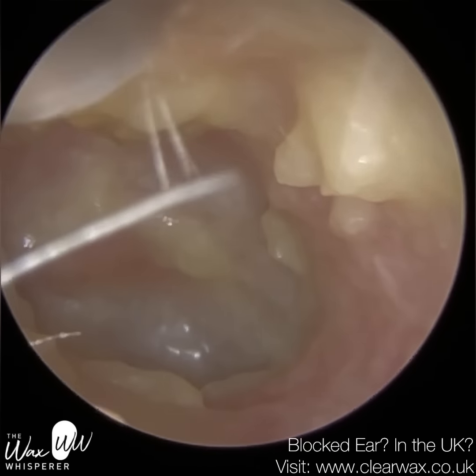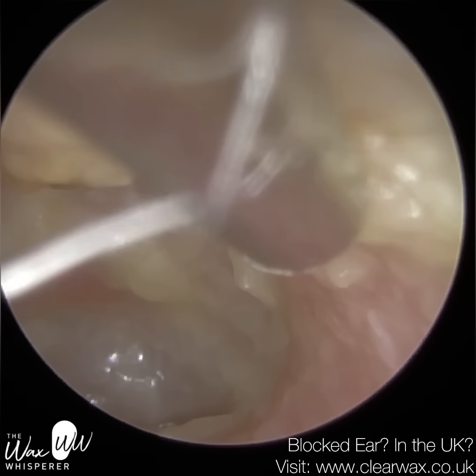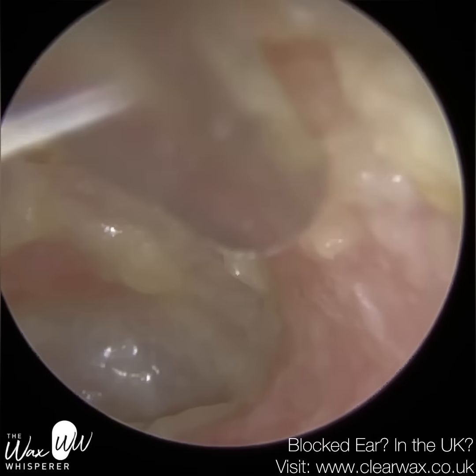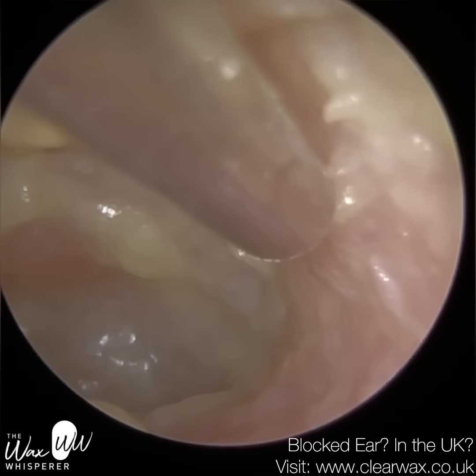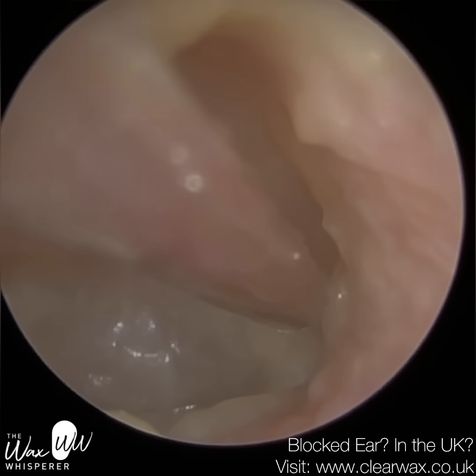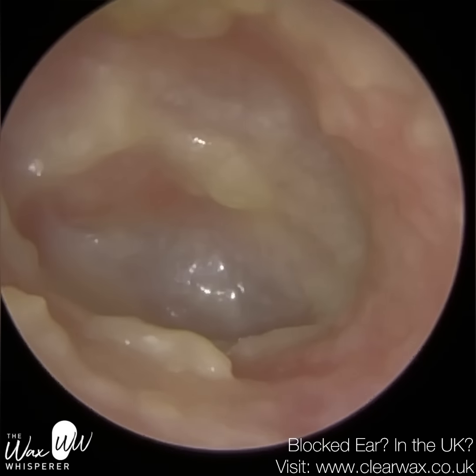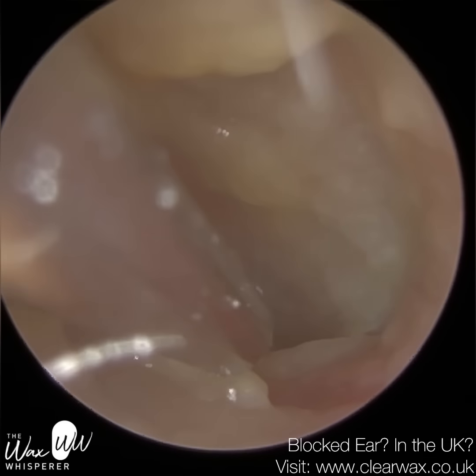So as you can see, this is not earwax. It's more of an infection. They've got otitis externa, and more specifically, they have got otomycosis, which is a fungal ear infection. And that will be more noticeable in their right ear because you can actually see the fungal spores and hyphae, I think that's how you pronounce it, those little woolly white strands, which are just sitting on the surface of the skin in their right ear. In this side, there were probably a few black spores mixed in with the debris, but it's a bit more difficult to diagnose whether this is a bacterial or fungal infection.